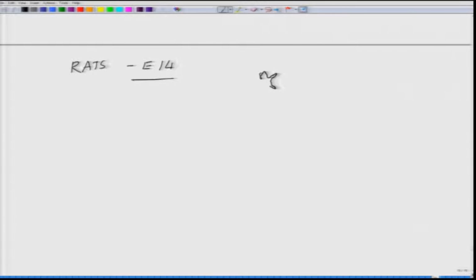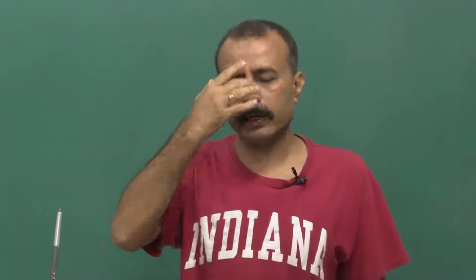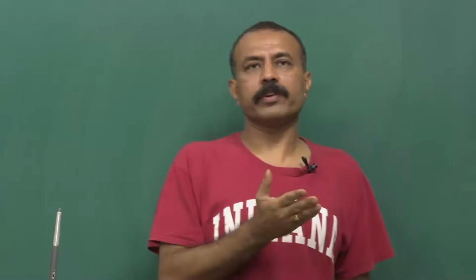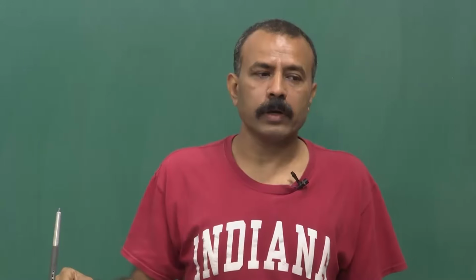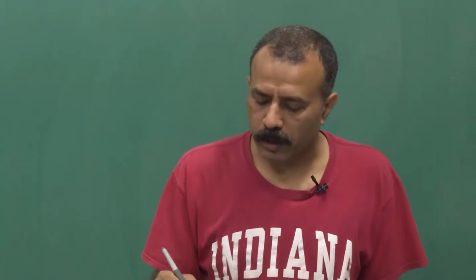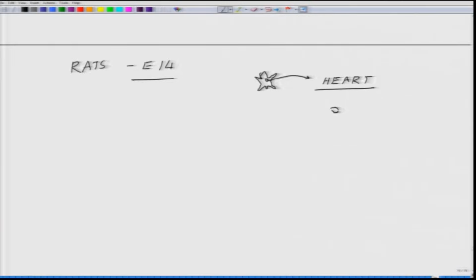What you do is you just take out the heart tissue, the complete heart. In this you will not be able to distinguish so easily whether it is a ventricle or atrium unless you have a very high-end dissecting microscope. That distinction will not happen. But instead you take out this small heart tissue, and once you isolate it, you will still see the blood vessels.